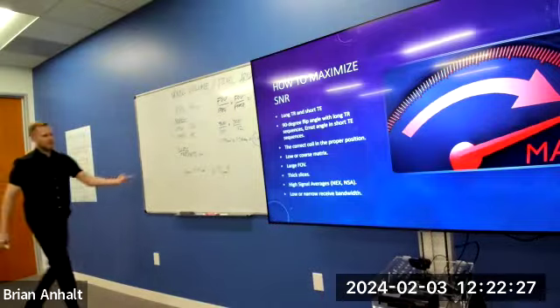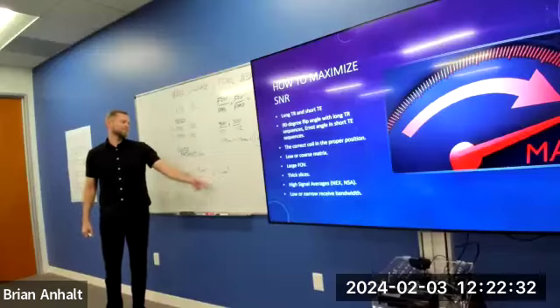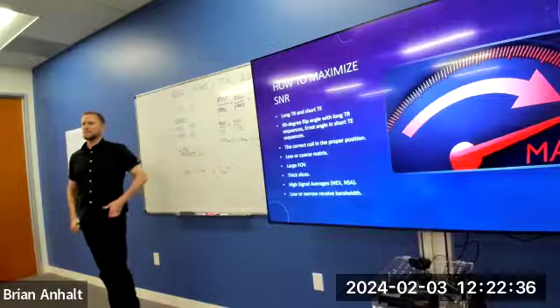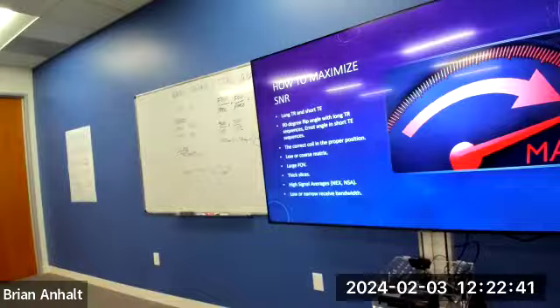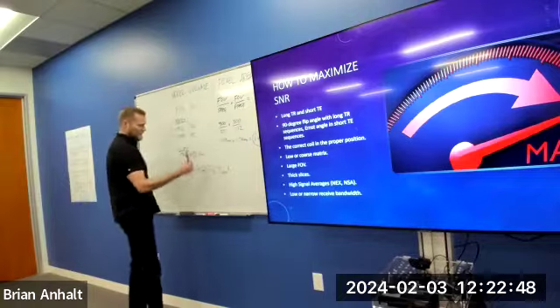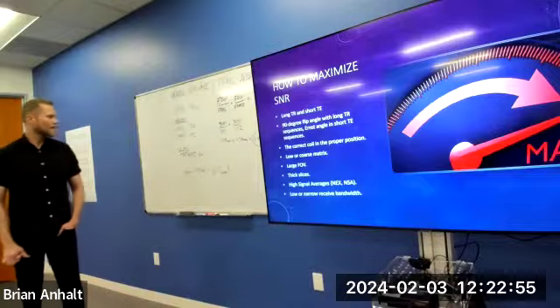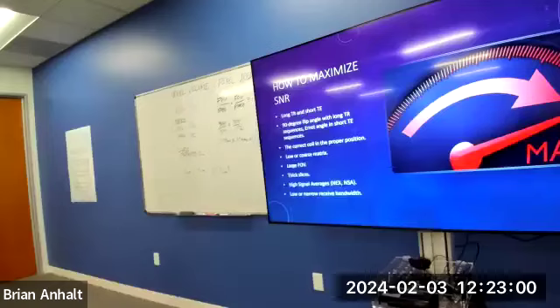And this kind of determines, you know, if we're looking at this, we can kind of figure out how much SNR we have, right? If this number went up, would my SNR go up or go down? Your voxel volume gets bigger, the SNR goes up proportionate to the amount bigger that it got, right? So if I doubled the size of this voxel volume, went to 17.2 or 17.4, then we'd have double the SNR that we did here.